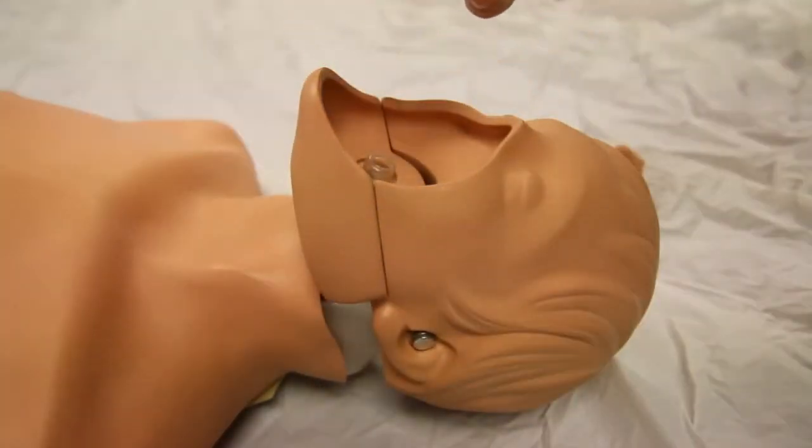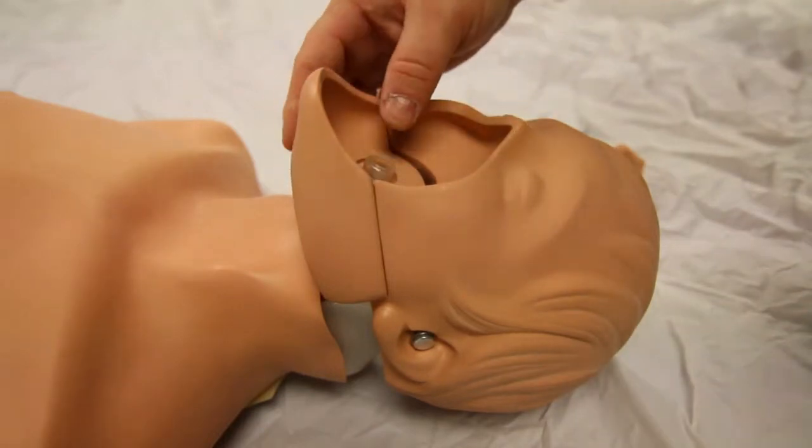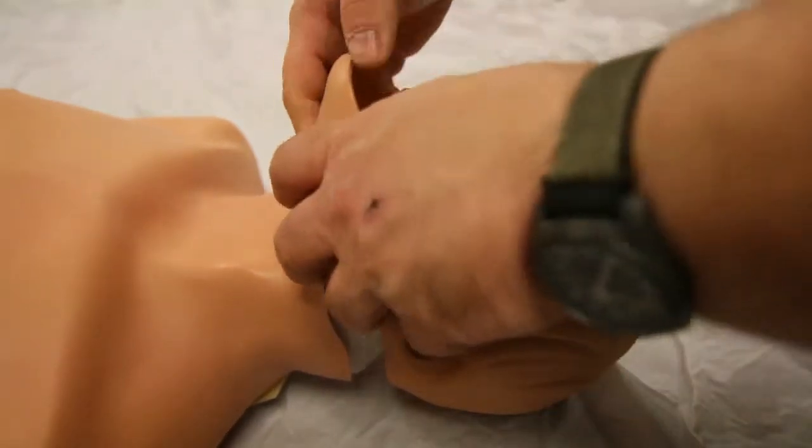The retaining ring pops off the lung check valve. The check valve pops out of the jaw for replacement.